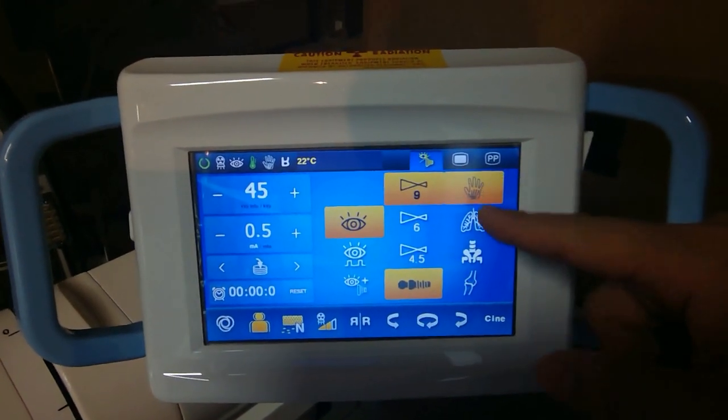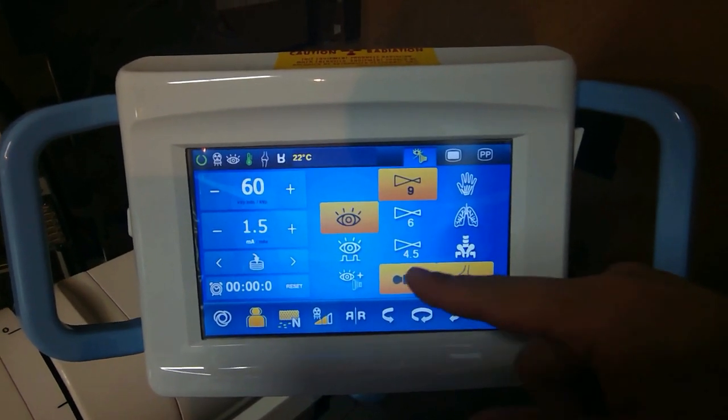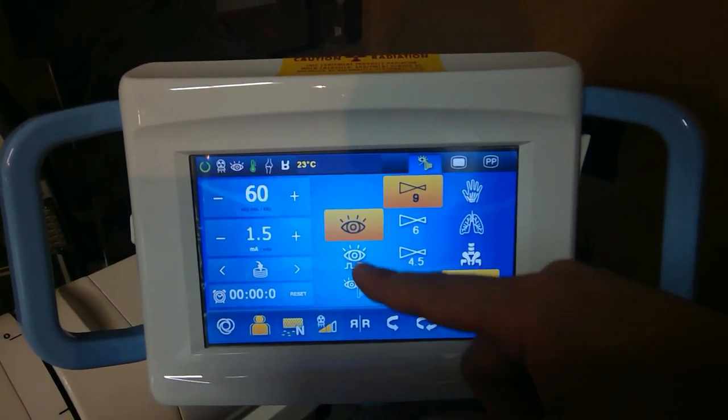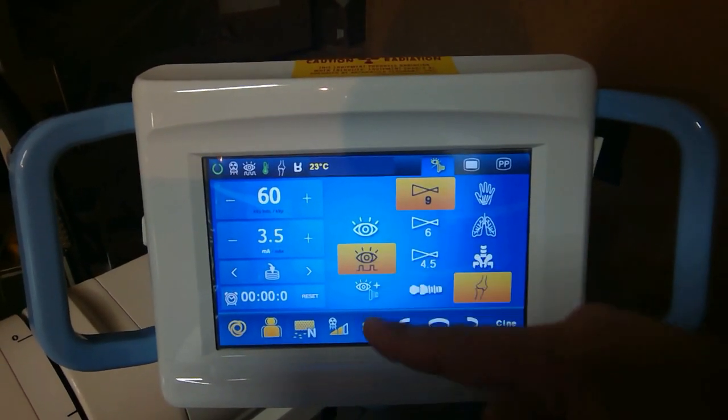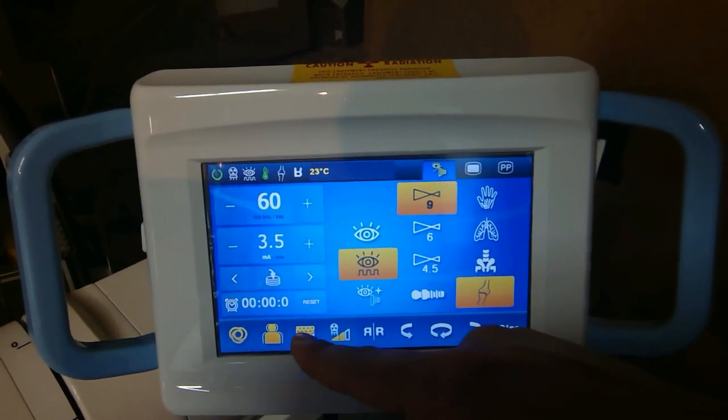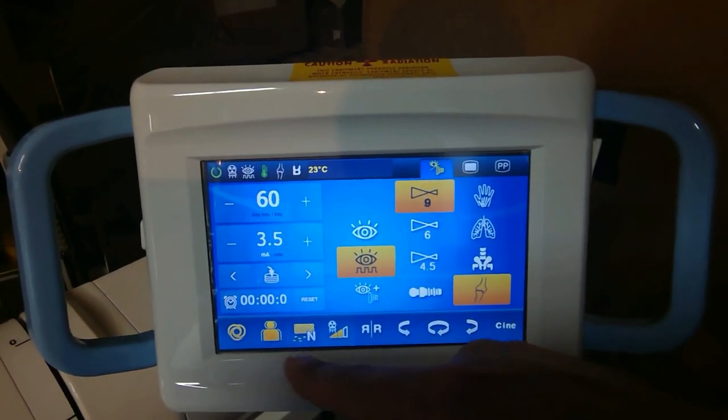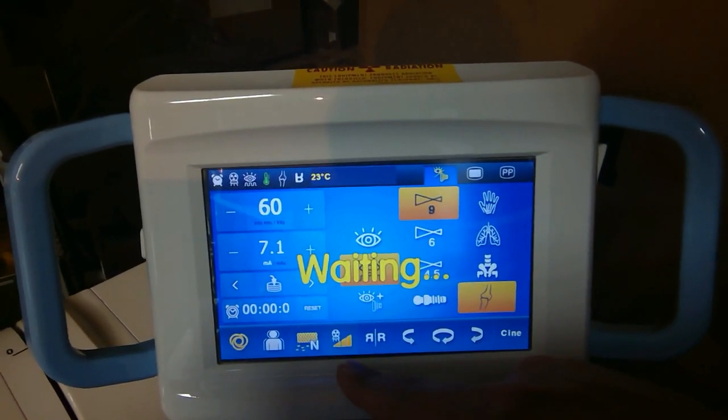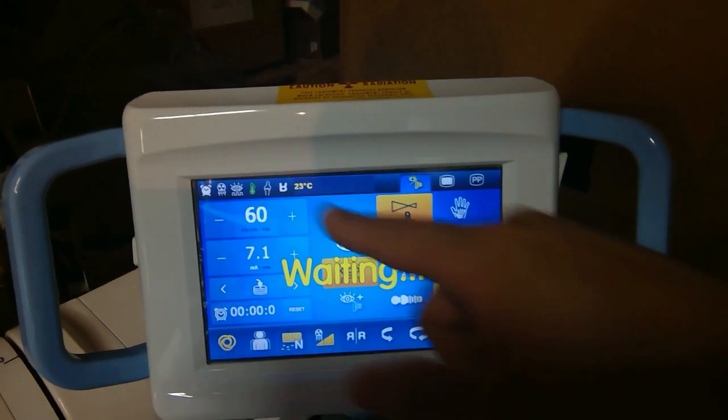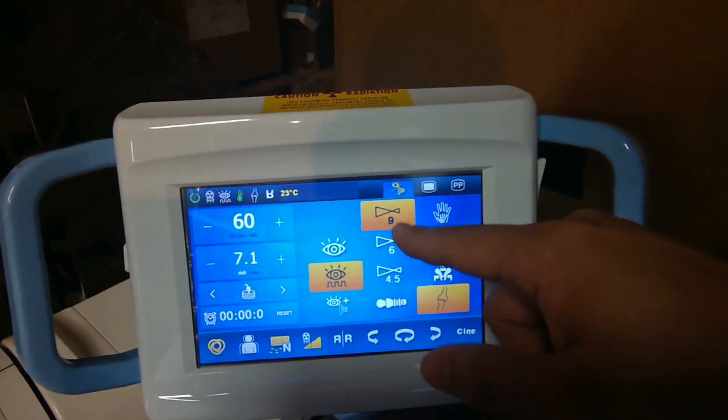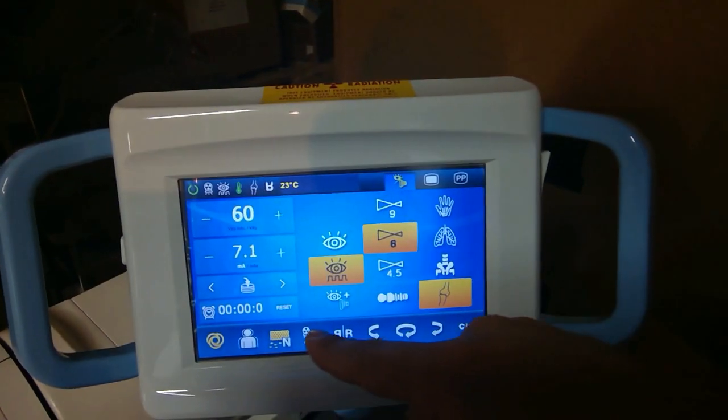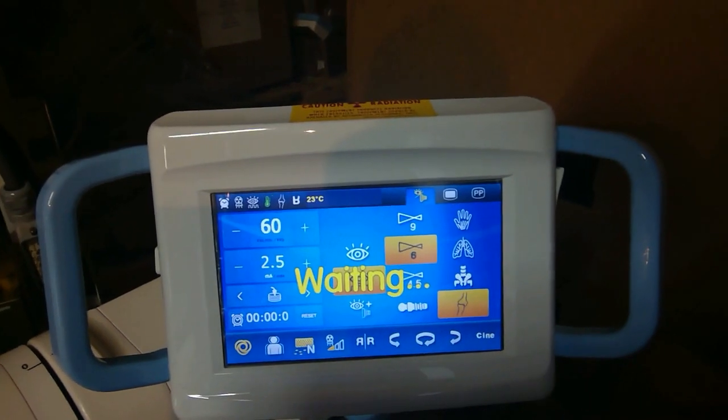This system has a lot of different options, such as the preset on the side, which is customizable, metal detection, motion detection, different pulse, continuous mode, filters, and all sorts of different options that are not common in other C-arms.